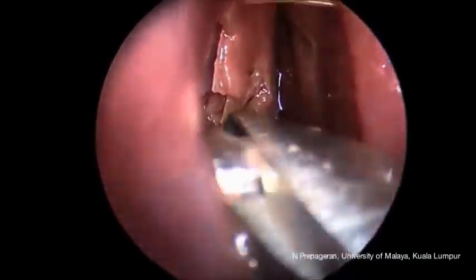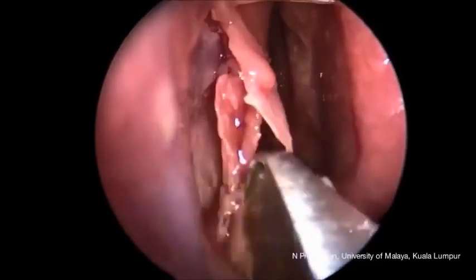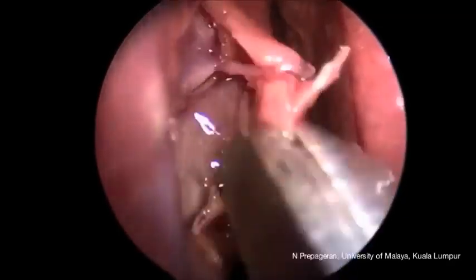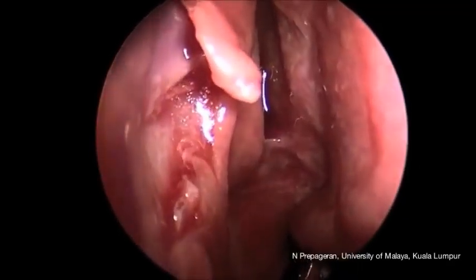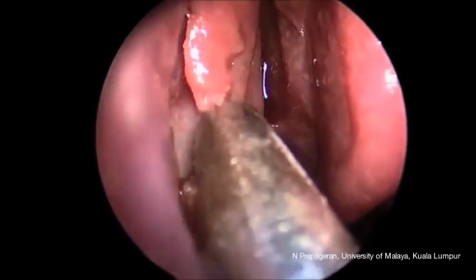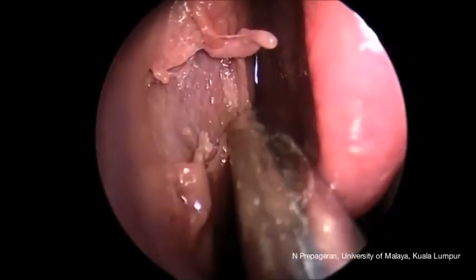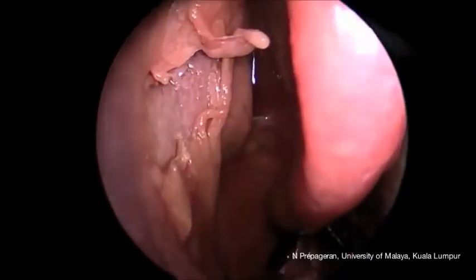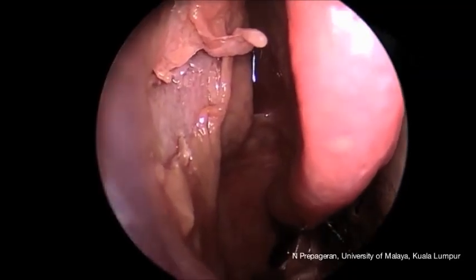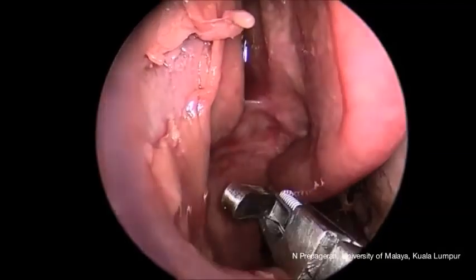So now let's see whether we can remove only the bone of the uncinate process, and therefore you can appreciate the blind sac that is covered by the mucosa of the uncinate process. There, as you can see, that is the blind sac that is like a blind sinus that is formed posteriorly with the uncinate bone in between in the shape of a boomerang.